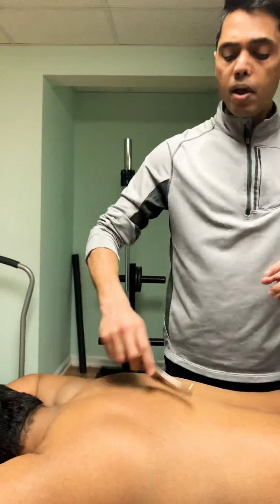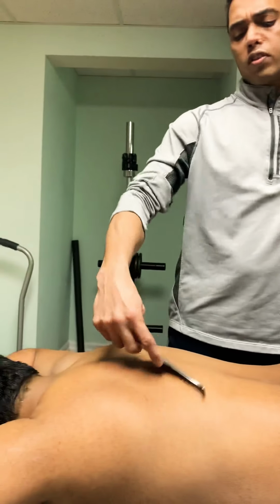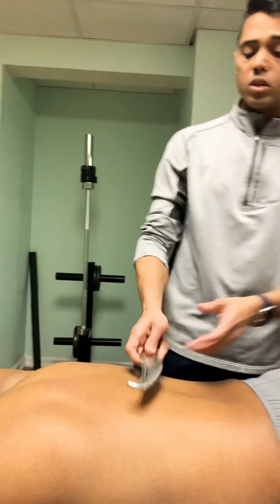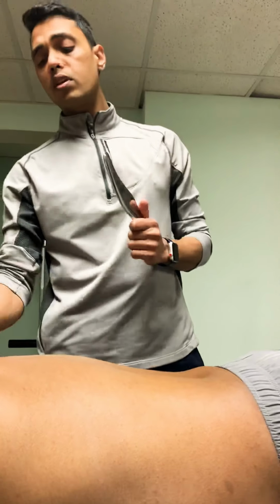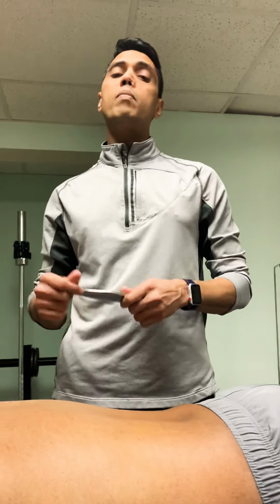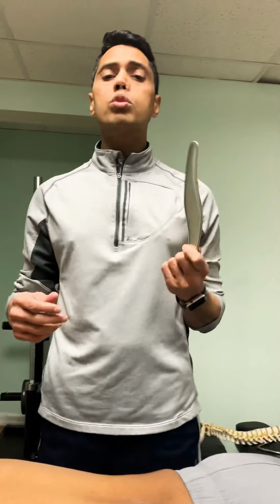But remember, all the motions for the fascia are in very different directions because the fascia is a matrix. It's blended like many layers between layers. So that's what you're trying to do. All this does is give the nervous system a different input so it can make a change. I hope this gives you an idea what these tools are for and how they are to be used.